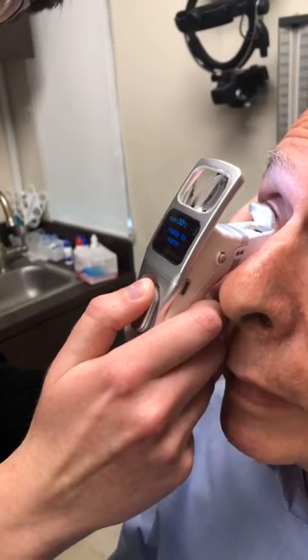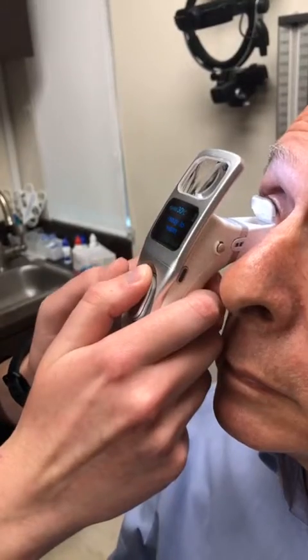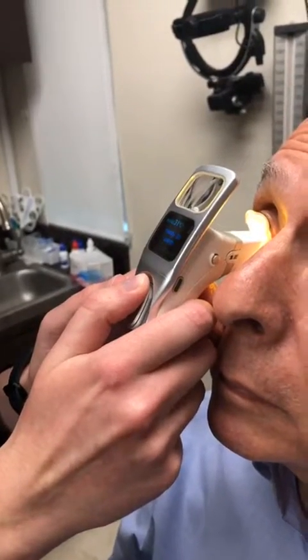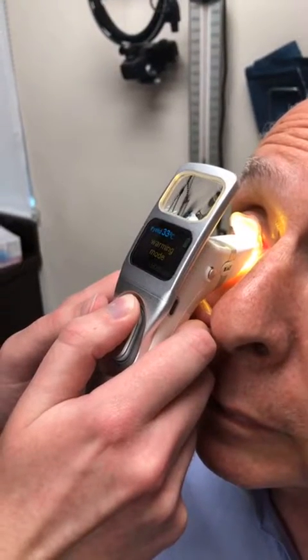Okay, what are we doing now? So now I am pressing the button on the instrument to warm your lid.